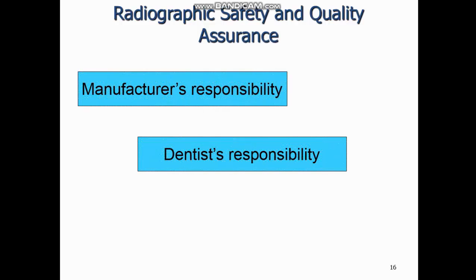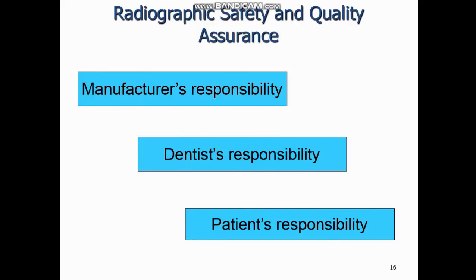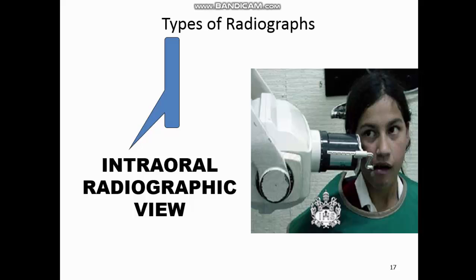Radiographic safety and quality assurance depend on three main factors: the manufacturer's responsibility, the dentist's responsibility, and the patient's responsibility.